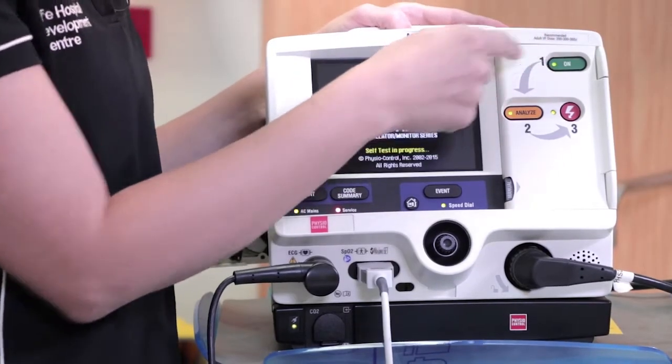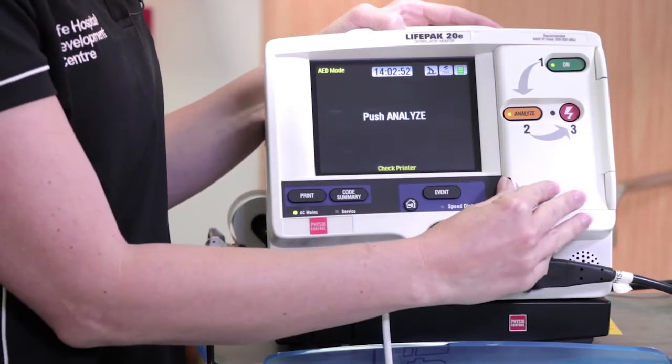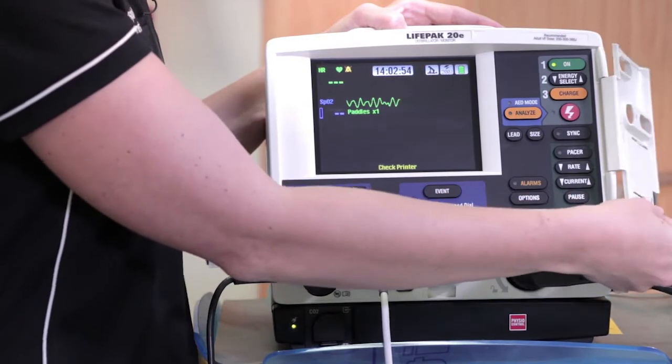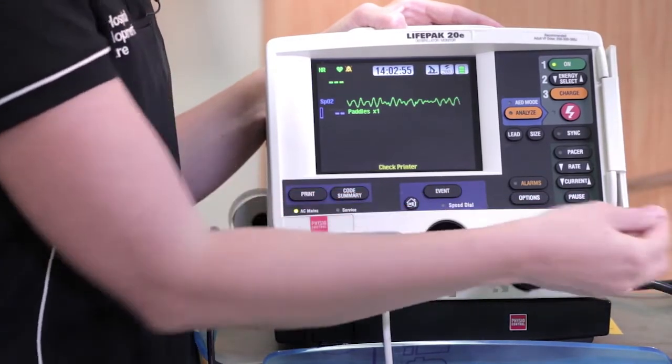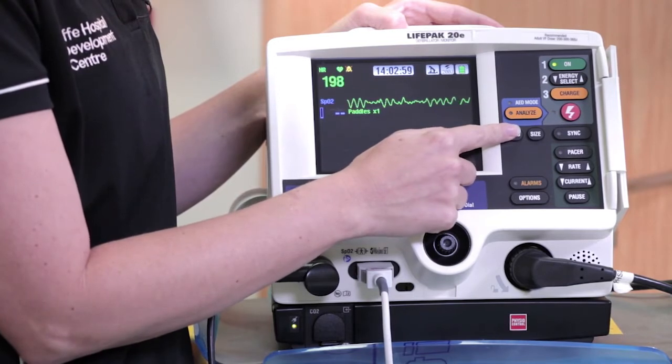Once the defibrillator is attached, we need to prepare for early defibrillation. Turn your LifePak on and open the door — this places the defibrillator into manual mode. However, if the door fails to do this, take the lead and push the lead button, which will also convert the machine into manual mode.